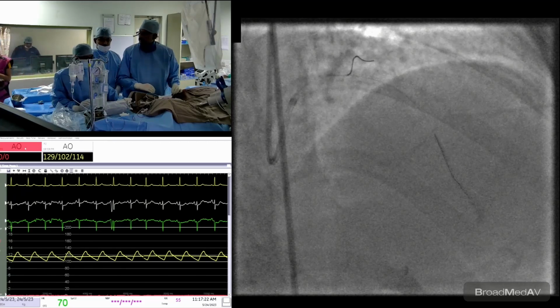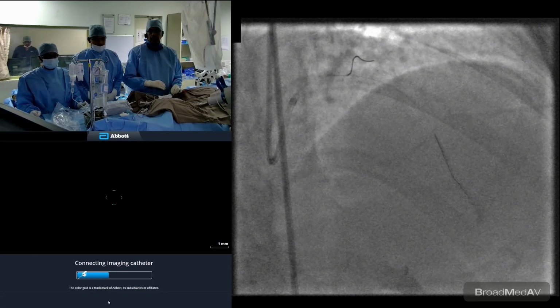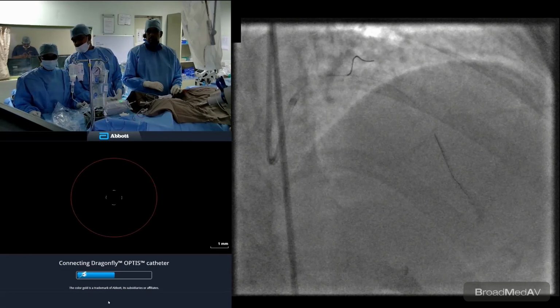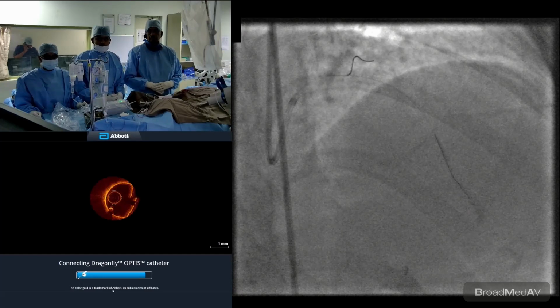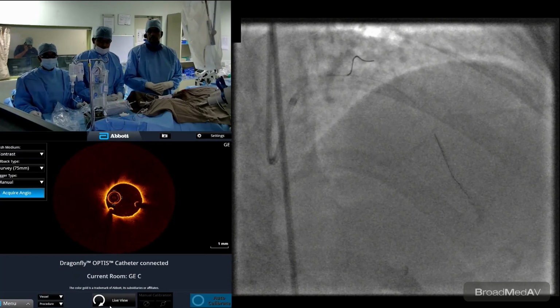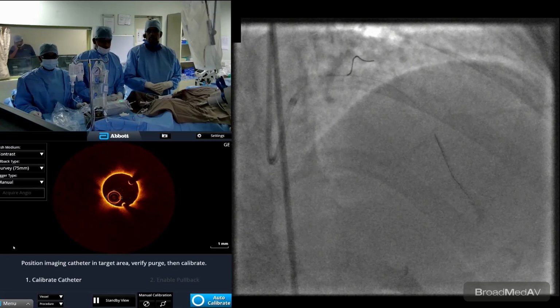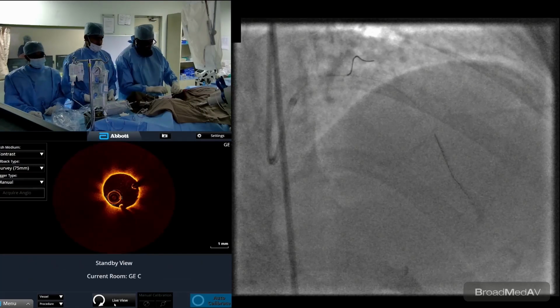Leave your hand. See, this is okay, right? See, it's fine. Okay, leave it. Should I get the catheter up, down? Yeah, you can take the catheter down.